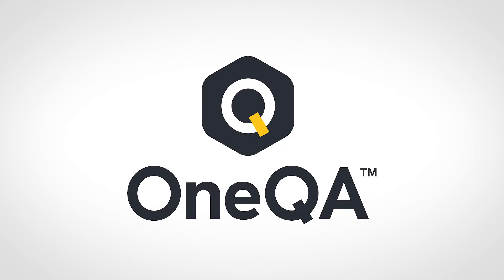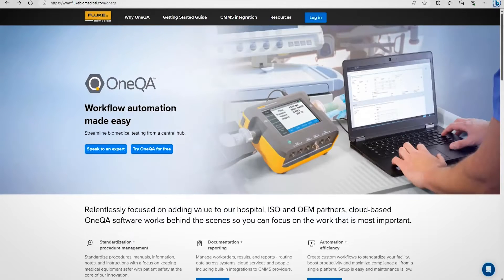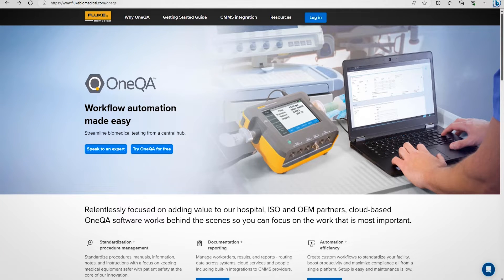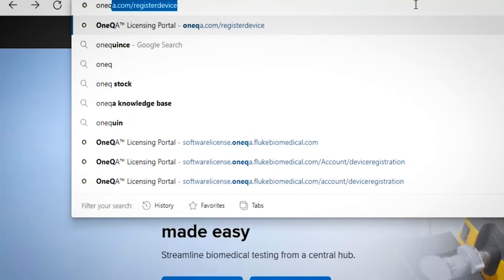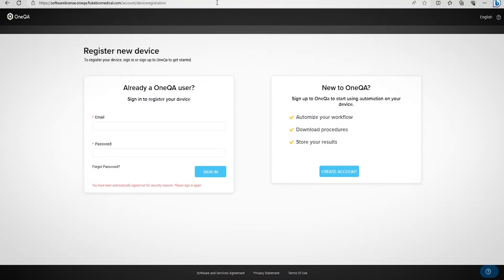In this video, we're going to guide you on how to create your OneQA basic account using your IDA6. Please visit oneqa.com/register device. This will redirect you to the software licensing portal.